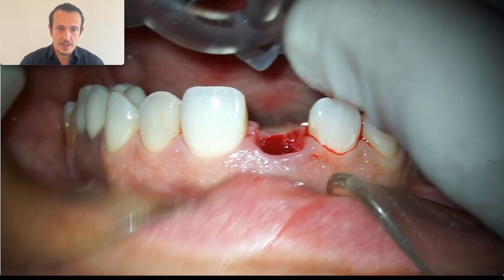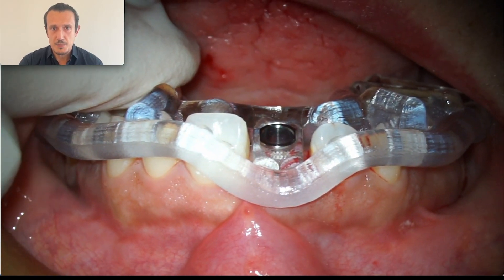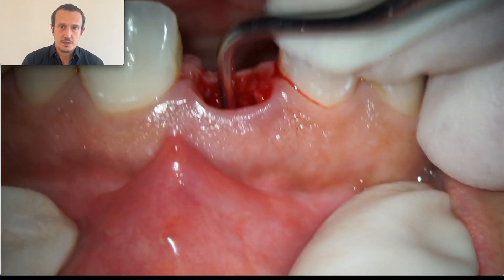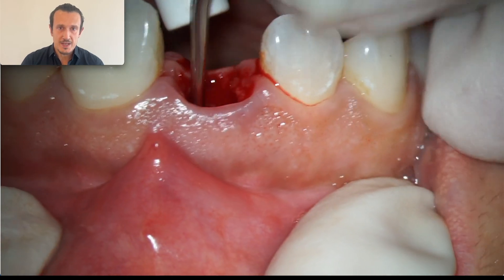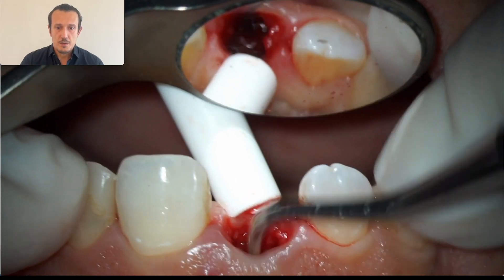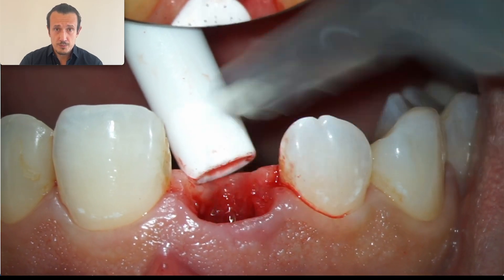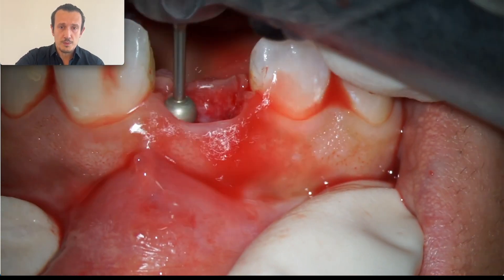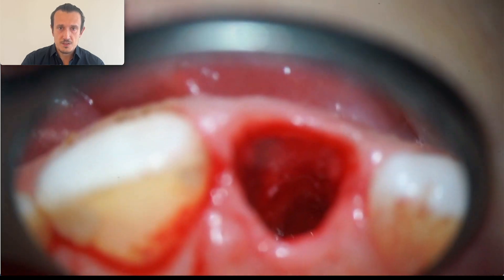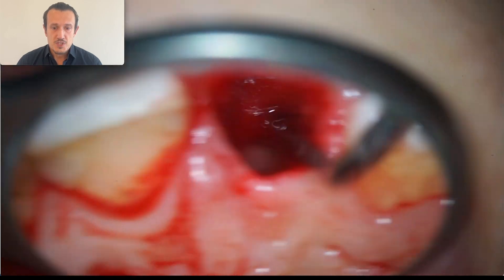This is the M-guide that I received — you can see how well it fits. After we check the M-guide we can proceed with implant placement. First I need to clean the socket; in this case I'm using a combination of blade curettes — this is a Lucas curette — and additionally I'm going to use a big round burr, I think a green burr, in order to remove the pocket epithelium. Remember, this is a case with external resorption that is infected, so we have epithelium going inside the socket.